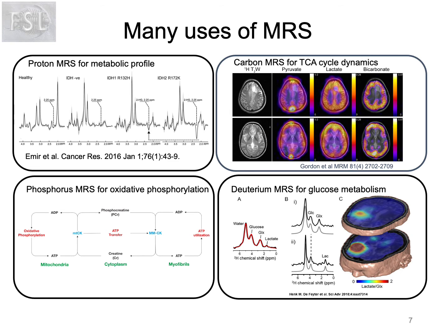Metabolic fluxes can be measured through the oxidative phosphorylation pathway or the TCA cycle, or by using harmless deuterium labels simply ingested by the subject. The Warburg effect in cancer has been imaged. However, in this presentation we're going to focus almost completely on proton MRS.